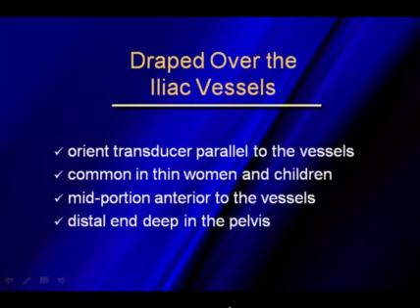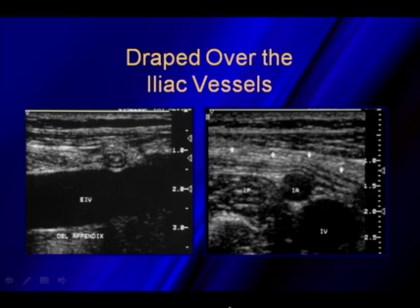This tends to be more common in thin women and children that will see the appendix in this location. What's difficult is the mid portion of the appendix will be anterior to the vessels, but the distal tip of the appendix will sort of dive into the pelvis. It's very important in evaluating cases for appendicitis that we evaluate the entire length of the appendix, and we'll talk about segmental appendicitis in a little bit.